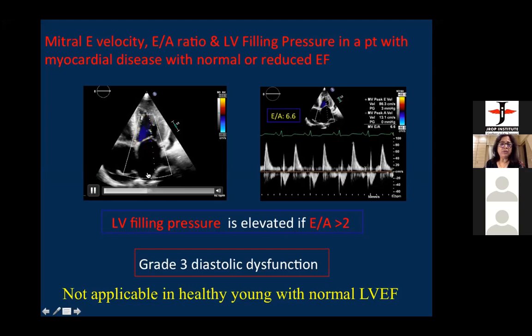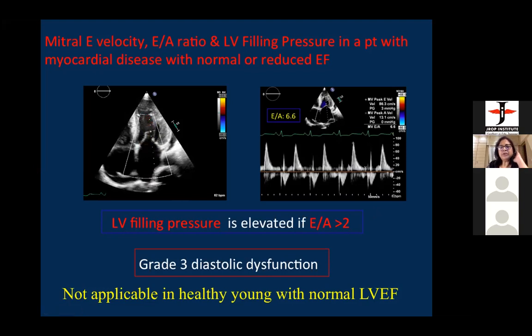small, though much of the blood is still remaining in the left atrium. The left atrium, in spite of having very high pressure, is unable to empty its blood to the left ventricle, because the left ventricle is non-compliant. It is not ready to receive the blood from the left atrium. So the A wave is very small. Is it clear?